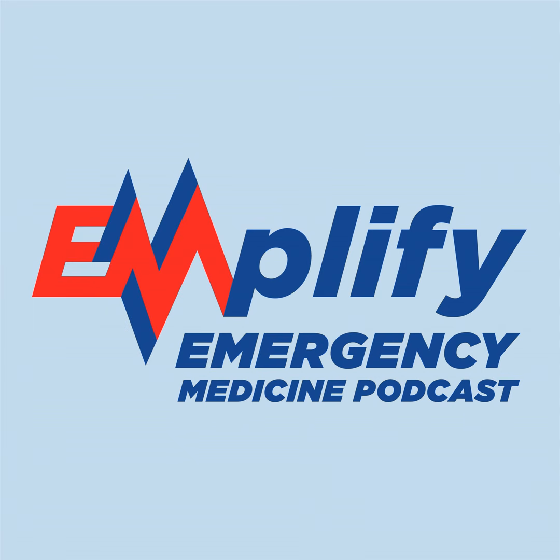And so trying to sedate them to get the respiratory rate that you have set is going to be the preferred strategy. There are some people who you might have to paralyze, but that, just like in ARDS, should only be done on a case-by-case basis and not routinely. So it's important that you start your sedation as early as possible and make it part of your intubation checklist, because especially now as more and more people are using rocuronium, your induction agent is likely going to wear off way before your paralytic is going to wear off.